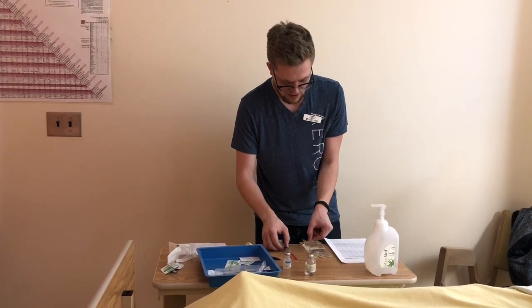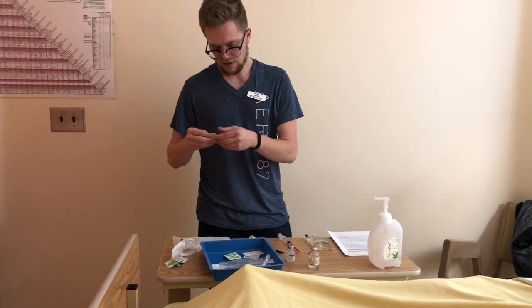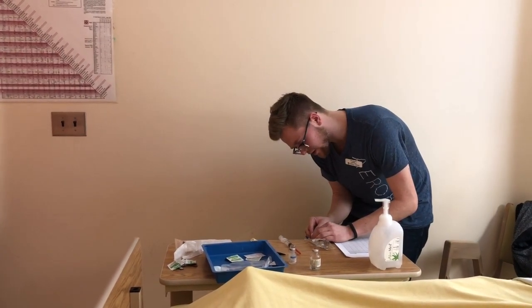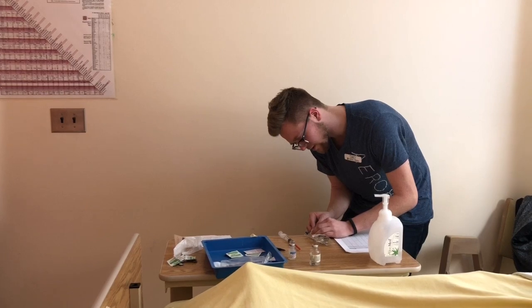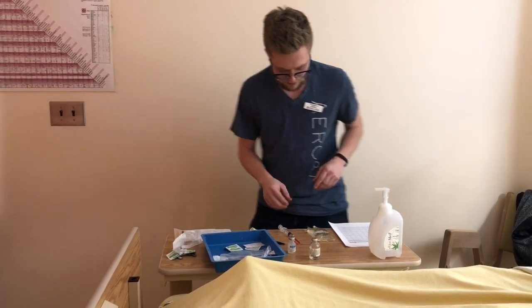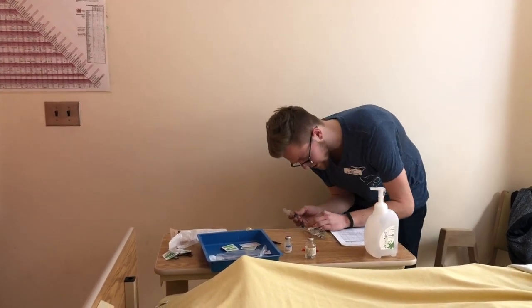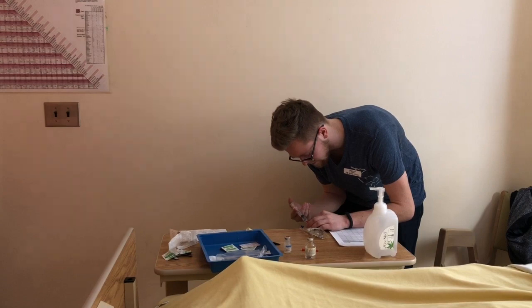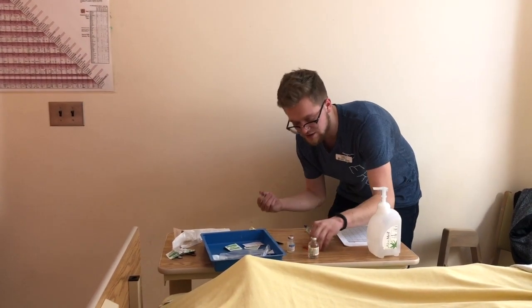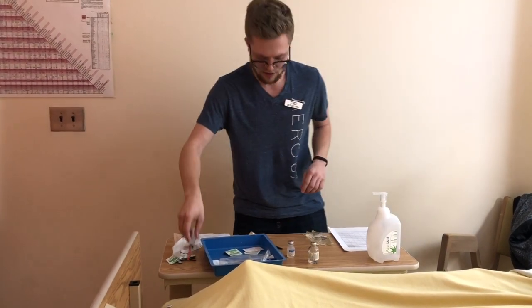Now we're going to be wiping this down. So again, we're going to do 30 and 30. So 30 and 30. Now we will be injecting into our mini bag there. Okay, good. And now this is done with, so I can toss it in the sharp. So I'll just put it off to the side here.